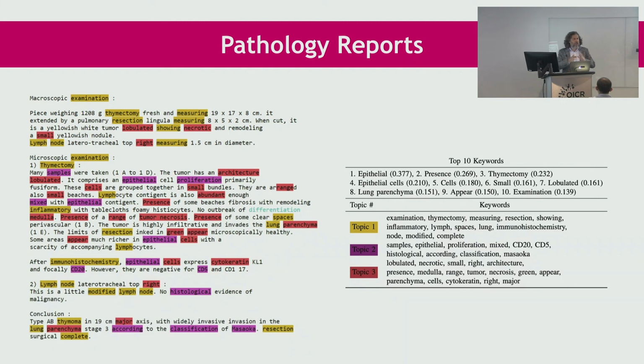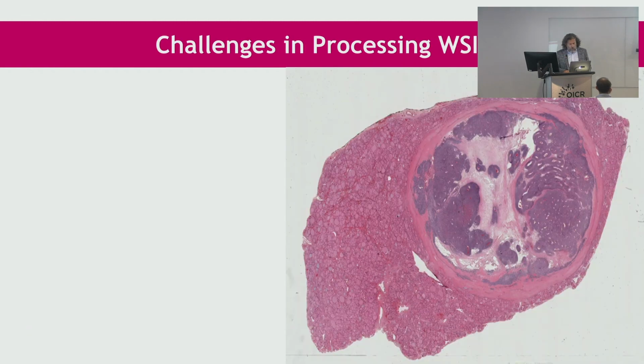Okay, so we understand the breast lobular carcinoma is not that difficult, let's say, and we can delegate it to the computers, and computers do 500 a day, and then the pathologists will come in and sign off. Look at them, yeah, no, the stupid computer has made a mistake here. So we need that transition to make sure that we gain trust in what computers do.